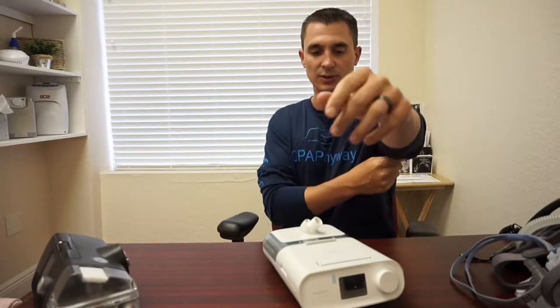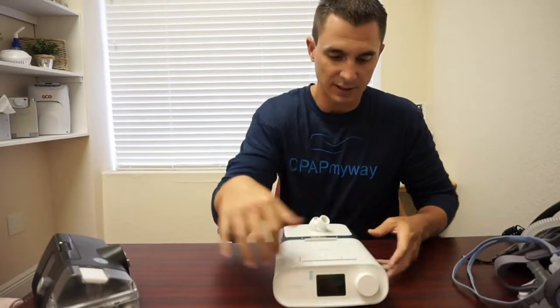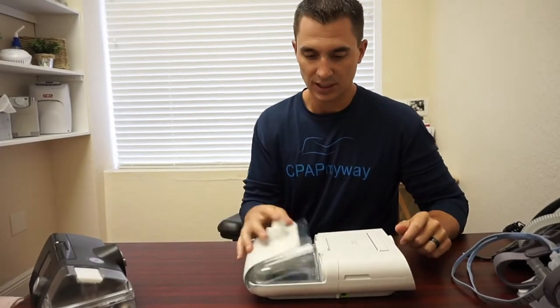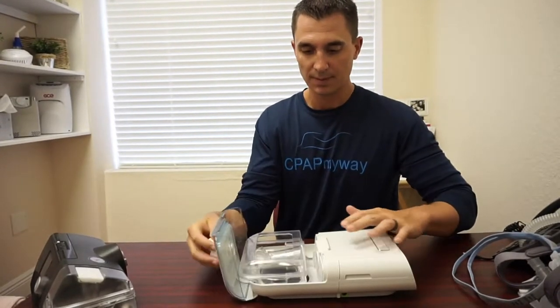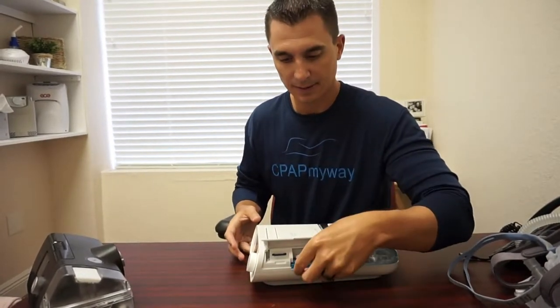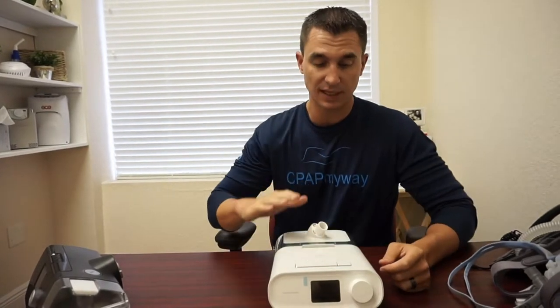We'll start off with the DreamStation. Looking at the DreamStation here, you'll see that on the front you've got all your setup information. On the back, you've got the humidifier chamber, which opens up here. And then additionally on the side of this one is where you find the filter set. As far as maintenance on most CPAP machines, there's really only two things to deal with in addition to the tubing, and that is the filters and the humidifier.